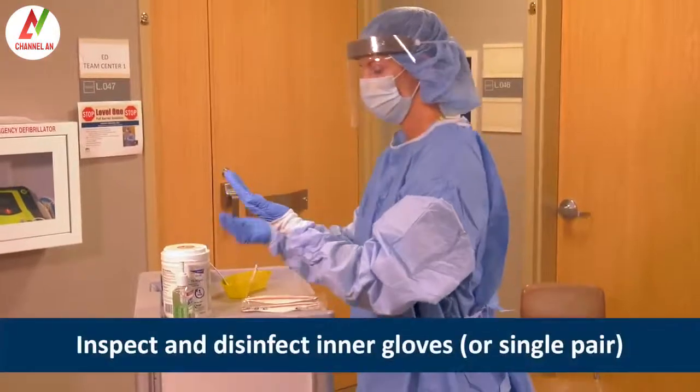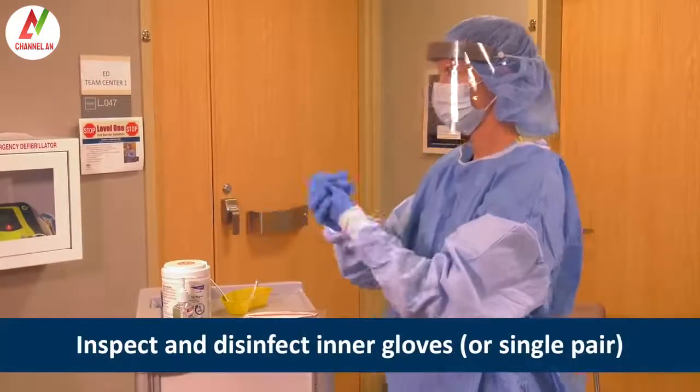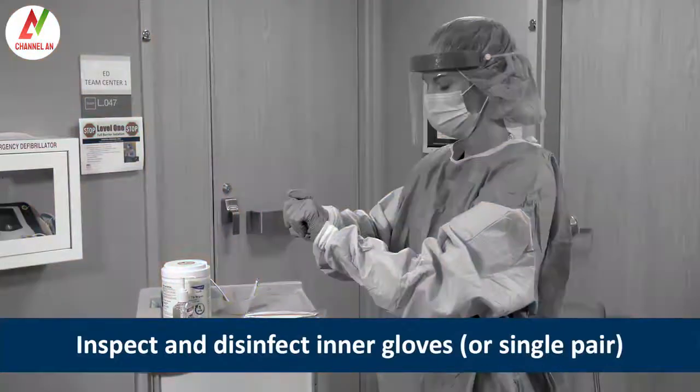Next, Heather inspects and disinfects her inner gloves. If a single pair of gloves was worn for a patient suspected of having a respiratory illness, inspect and disinfect.